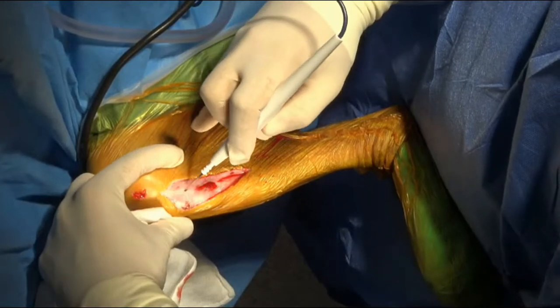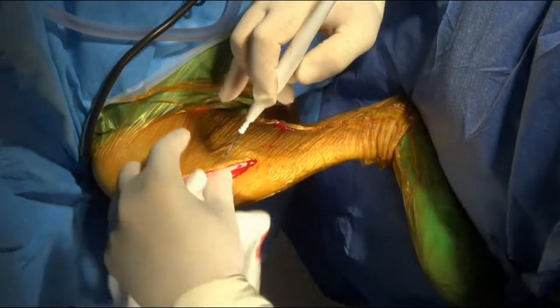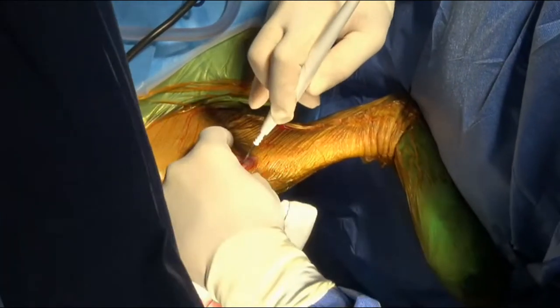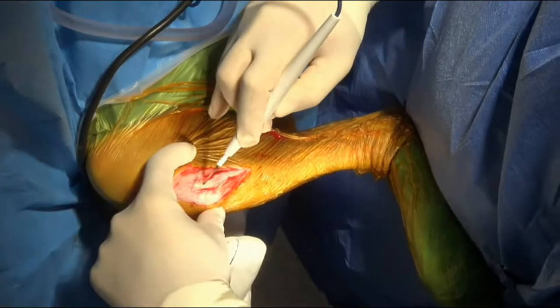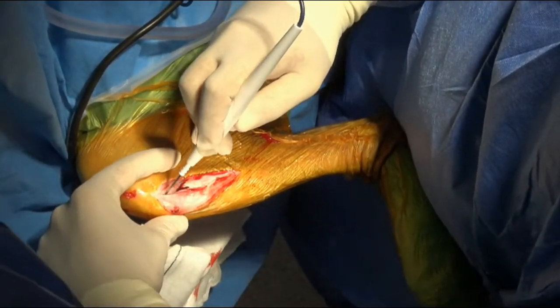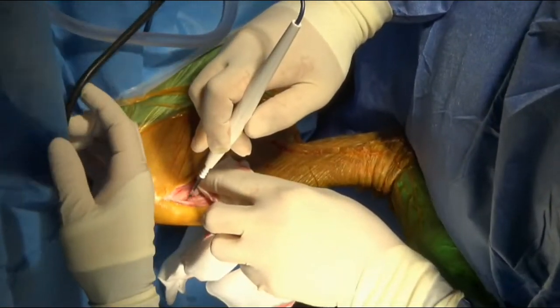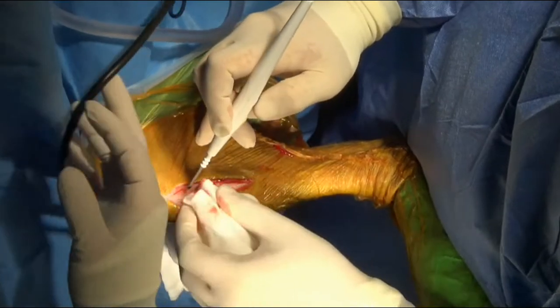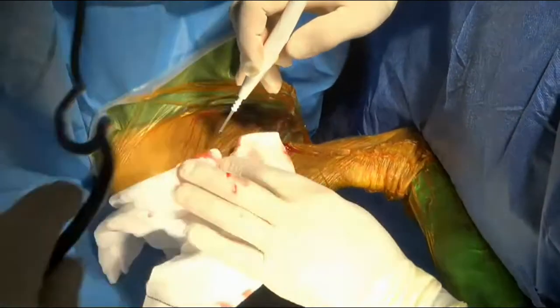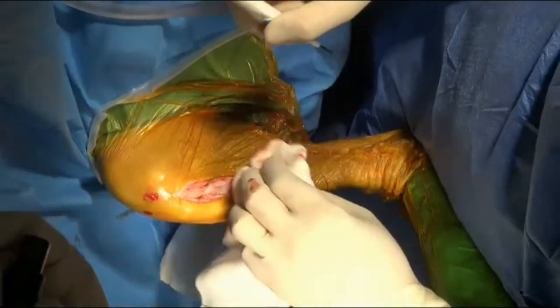Interestingly, this dog actually presented for an assessment of bilateral hip dysplasia, and when it came in, we actually diagnosed him not only with hip dysplasia but also with bilateral cruciate disease. So he had the first leg operated a couple of weeks ago, and now we're going to operate on the second side. Generally, when I'm doing TPLOs or these CBLO procedures, I don't like to typically do them bilateral in a single session at the same time. I'd prefer to stage them by generally a couple of weeks.